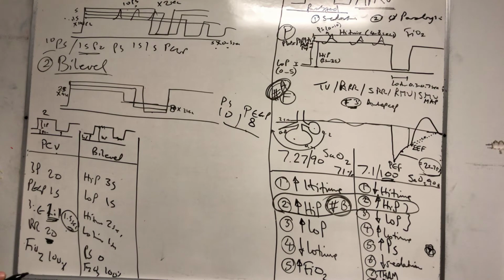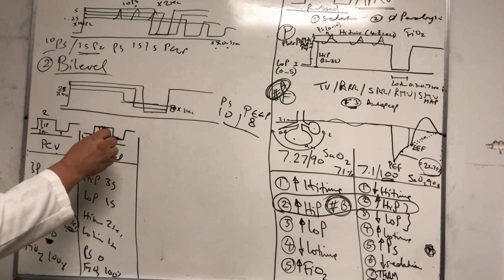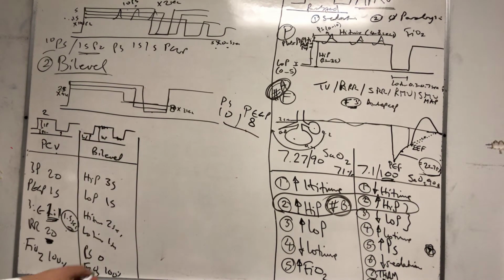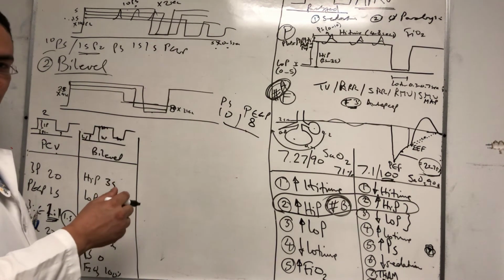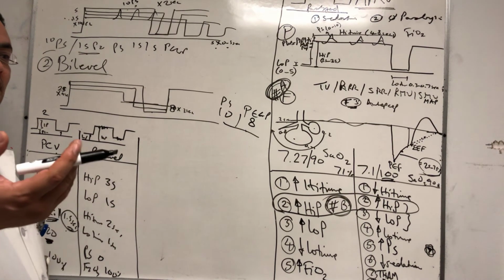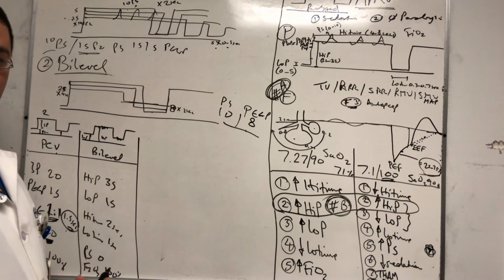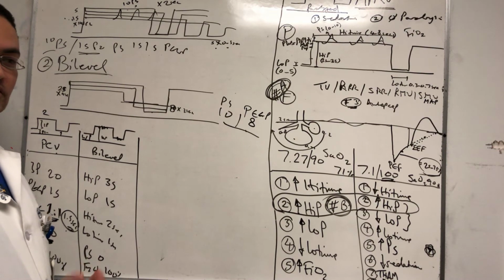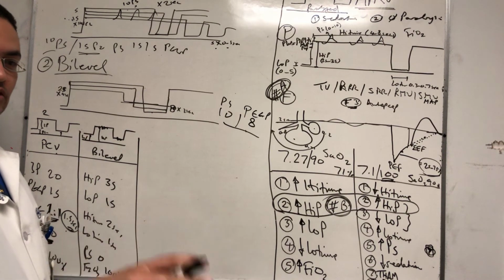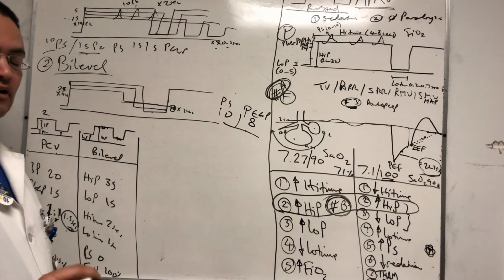So what we decided is, why don't we just switch to bi-level, which gives you 2 levels exactly the same, and the patient, when he wakes up, breathes on top here and breathes on top here, right? So the night I am switching to bi-level, I'm having diarrhea. Why? Because I can kill people with this, right? Professor Megan comes in, overdoses on heroin, and she has a normal lung. We put her on the vent only for airway protection. She doesn't have an ARDS lung, right?